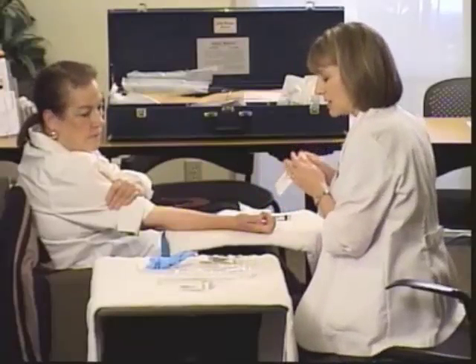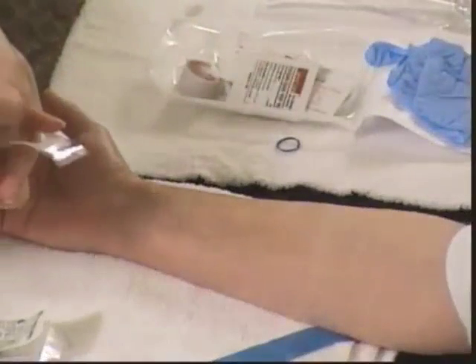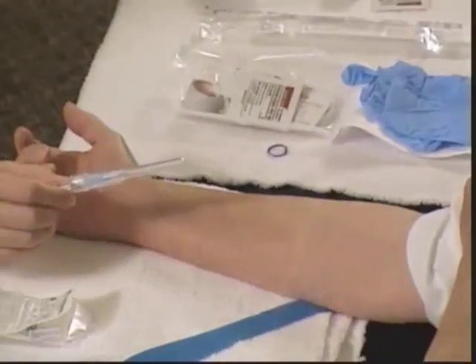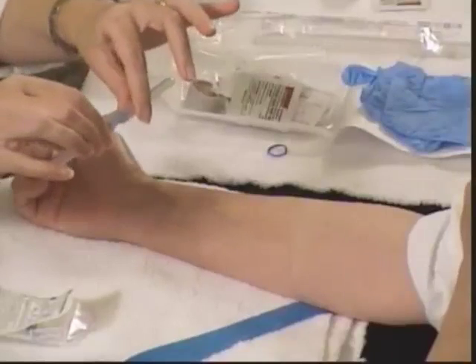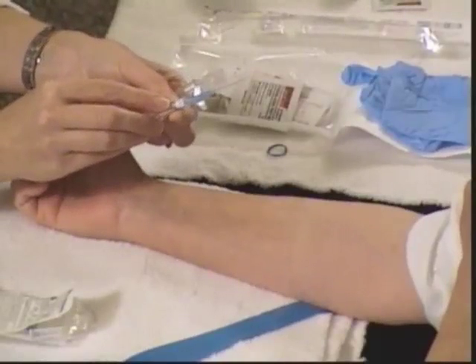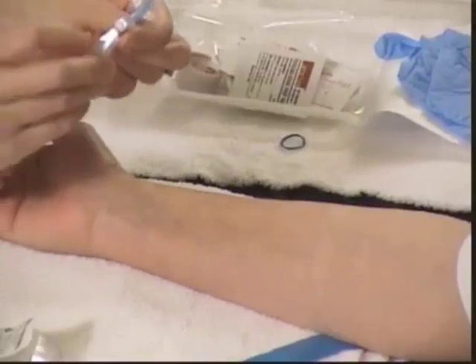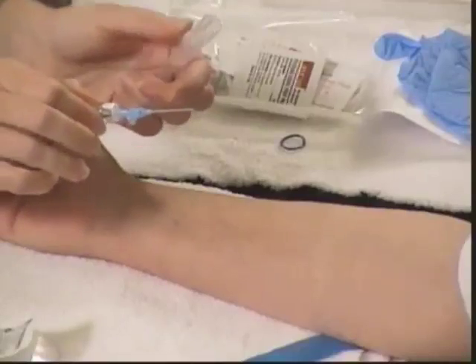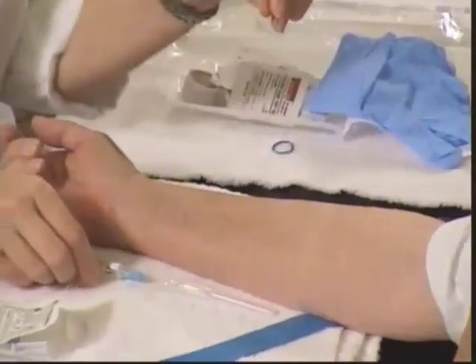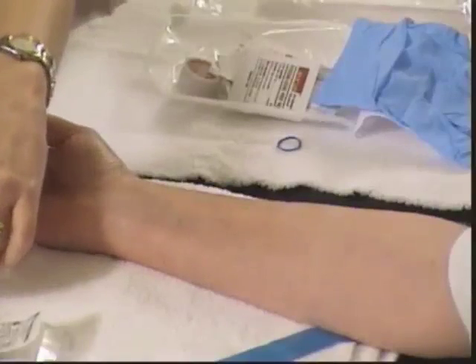We've finished setting up our supplies with the tourniquet off, got that flushed, and now we're going to take the IV catheter out of its packaging. What may be new to you is that these are safety needles. When you take the cap off, you pull away to expose the needle and catheter. This white button is the button that retracts the needle — don't push it until you're ready. When you recap it, just lay it down on the table so you don't risk puncturing yourself, and set it to the side until you're ready to use it.